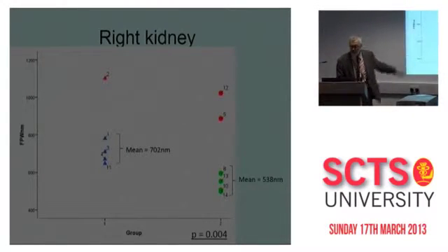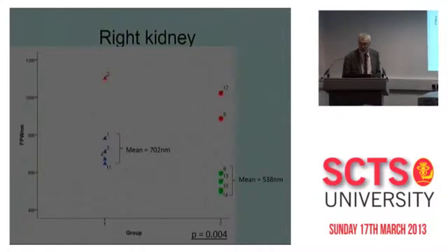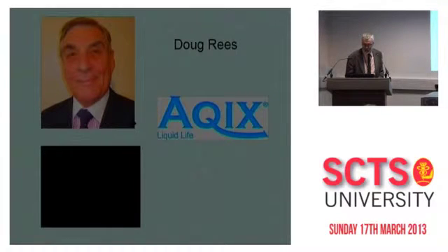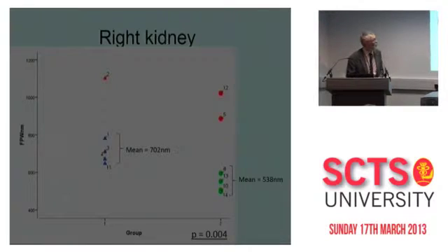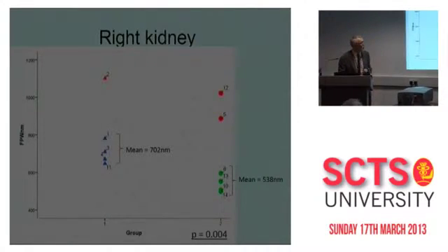So the left-hand side, this one's the cold, and this one's the warm. And if you cock it up, it's actually far worse for ECMO. So we found that ECMO is good provided you do it properly.